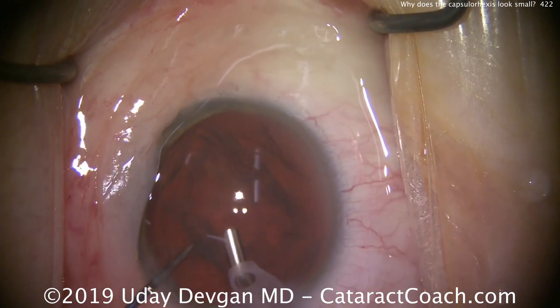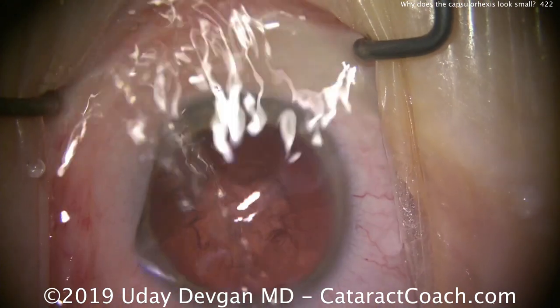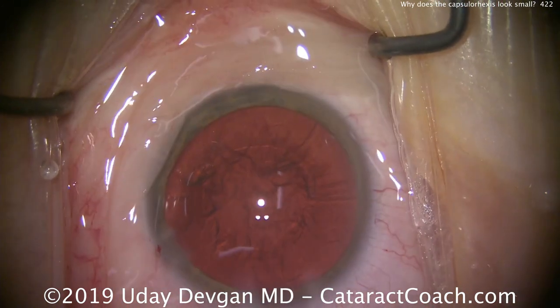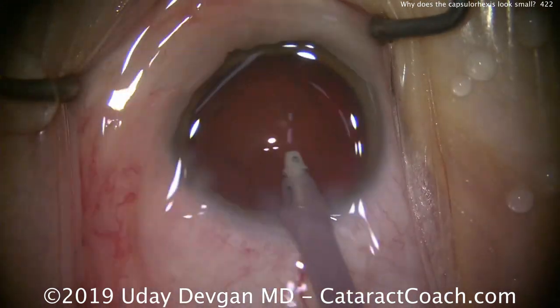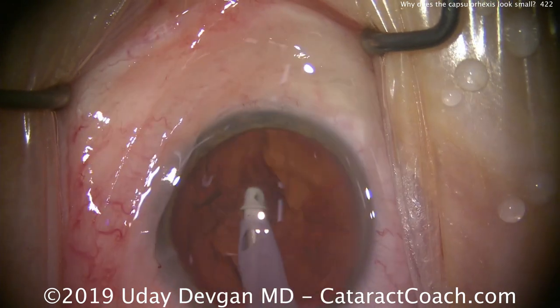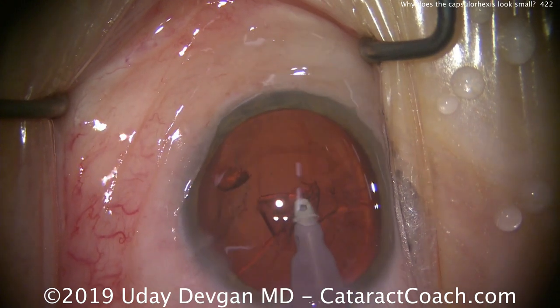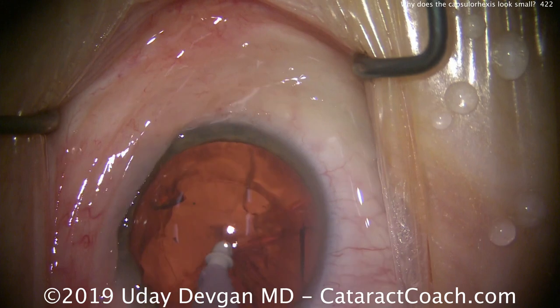This patient is going to receive an IOL with a very low power — just two or three diopters in strength — and that's going to leave her with a myopic outcome. There's a little bit of chemosis; we'll just push that down with the spatula, then switch over to the IA probe and clean up here. Now these very large myopic eyes — sometimes like in this case — the capsule can be quite thin. You want to be very delicate and very gentle.